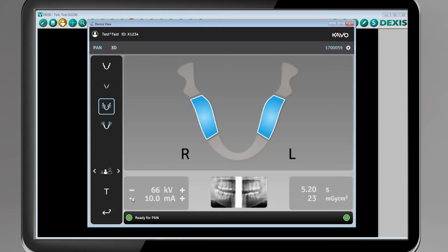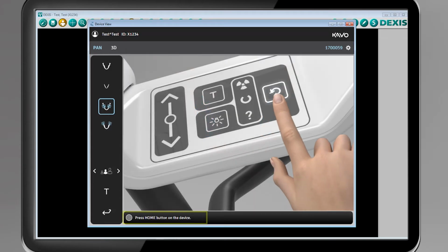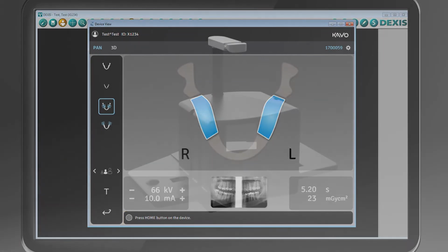Now that the patient size and protocol have been selected, the device status indicator message bar displays the device status with the color-coded device status indicator. Green indicates the device is ready for imaging. A gray indicator means that the device is not ready for imaging. This status will be accompanied by a prompt indicating steps for resolution.